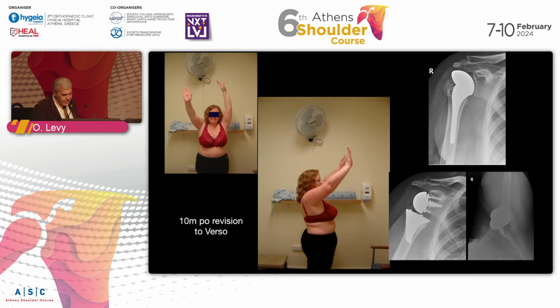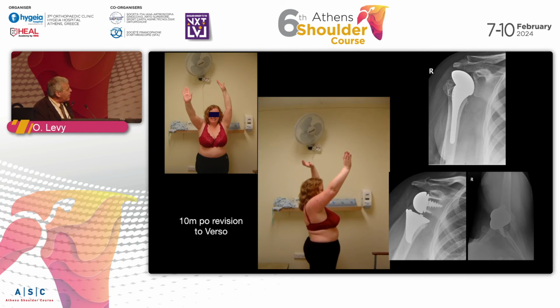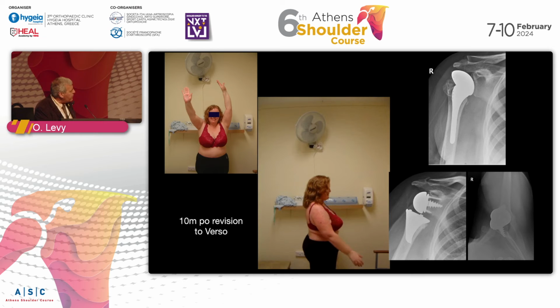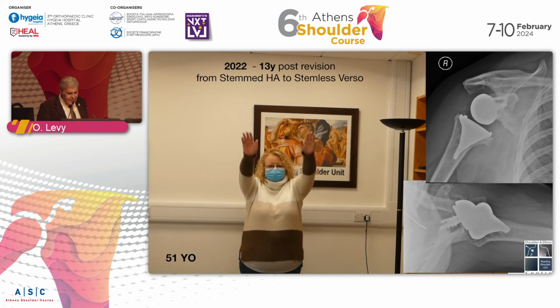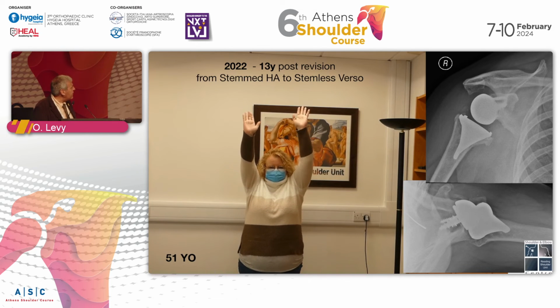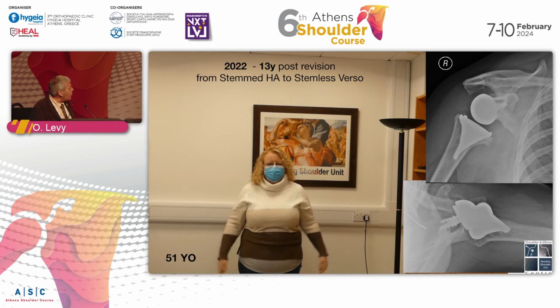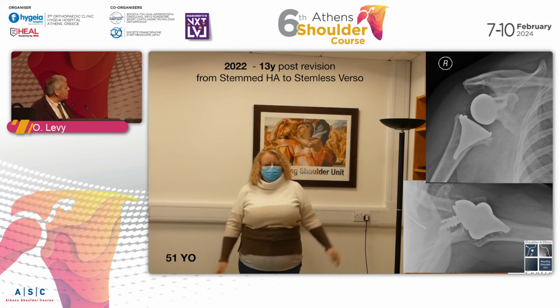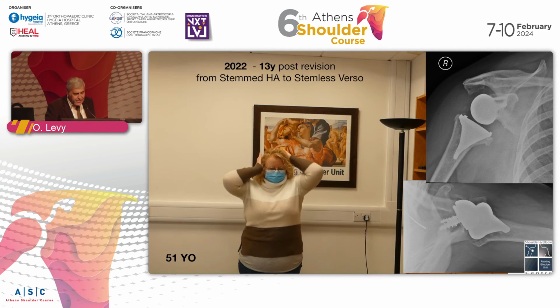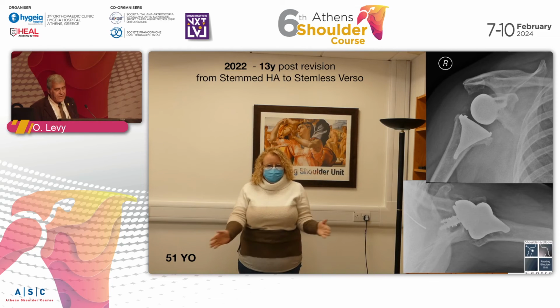After a long discussion with her, I revised her from a stemmed hemi to a stemless implant. This is 10 months after the operation. And this lady, 13 years after this operation, again, you can see good function and good x-rays. And she lives in the north of Scotland, and she comes every year to see me. She doesn't care. She comes to see me.